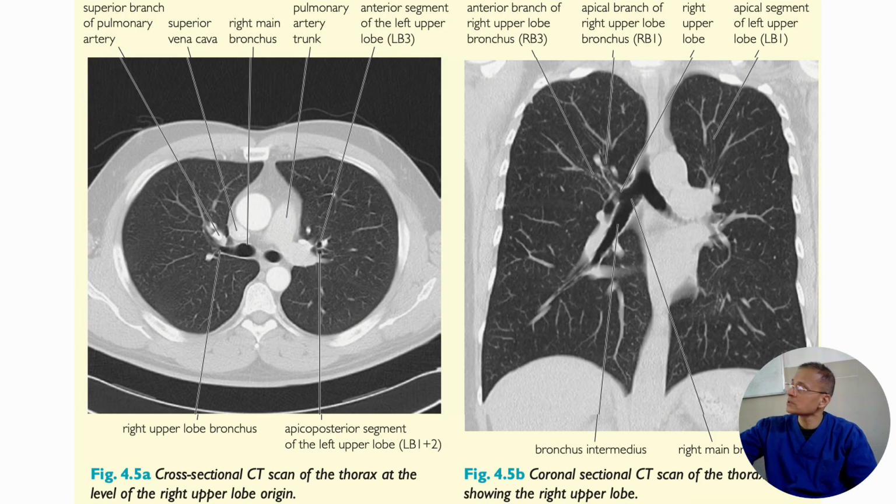So that has been shown in this picture. All the structures have been named here. It's labeled here, the previous image was without that. So you can see all the images. This is in the coronal view, this is in the axial. For us, in fact, we exactly look at the lesion. The CT film, we must do the MPR. Axial, coronal, and sagittal, all the views should be reviewed by the physician. So this is what happens.